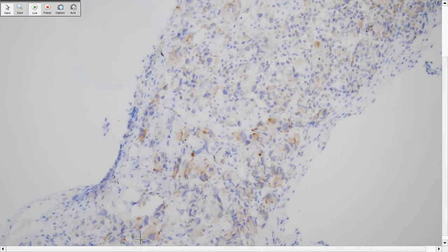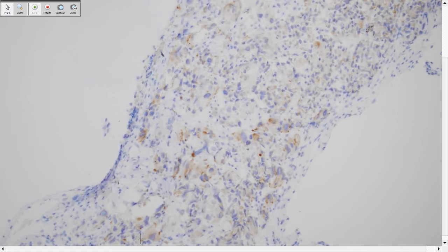If this is a high-grade thing, with single cells and sheets, especially when you don't see the urothelial part right under the top mucosa, in this kind of situation just run some immunostains, right? Get the correct diagnosis. Don't get it wrong. I don't know whether the patient is supposed to have the prostate or the bladder taken out. I don't know how it may affect the patient.